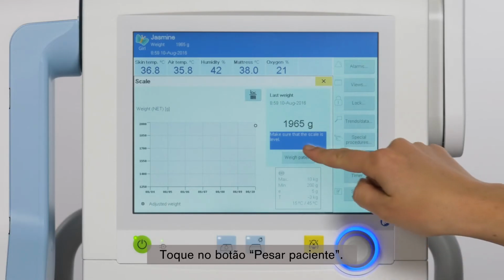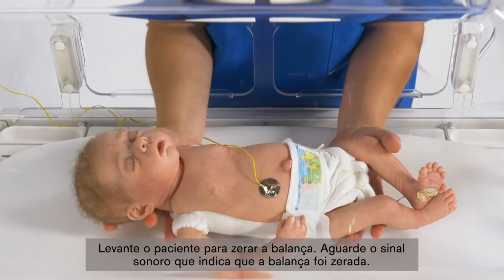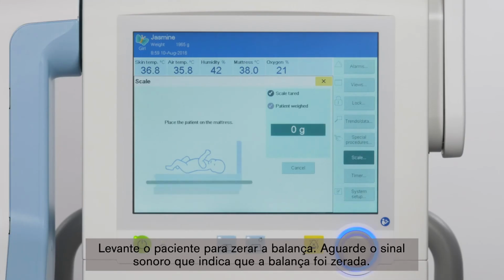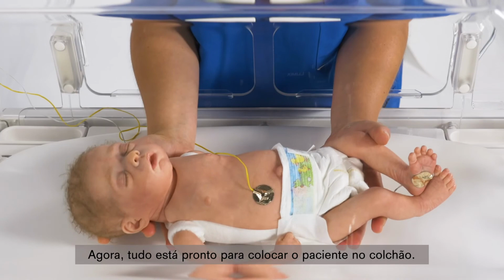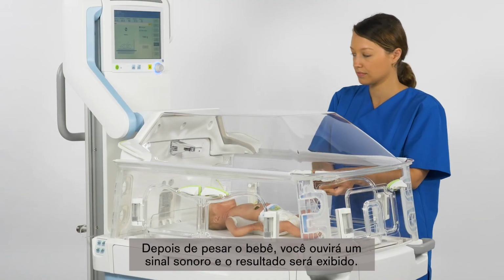Now touch the Weigh Patient button. You need to tare the scale by lifting the patient up. Wait for a signal to sound, indicating the scale has been tared. You are now ready to place the patient on the mattress. After weighing the infant, you'll hear a signal sound and the result displayed.